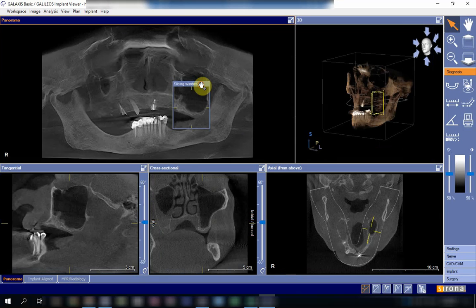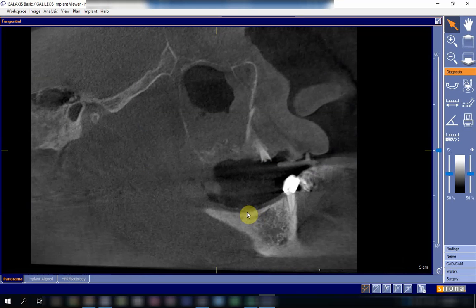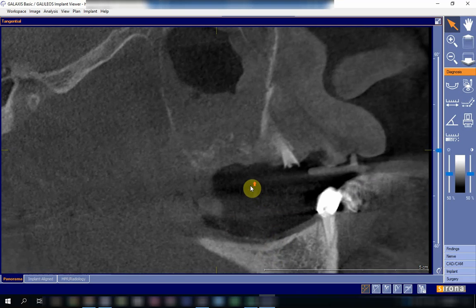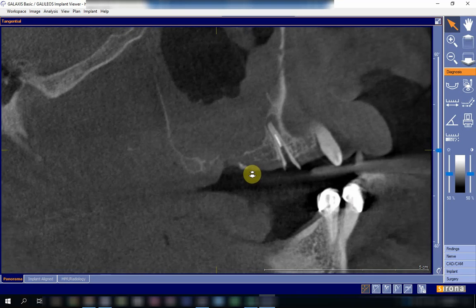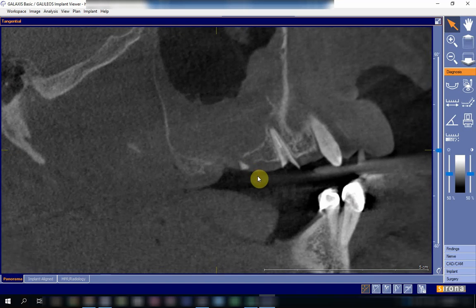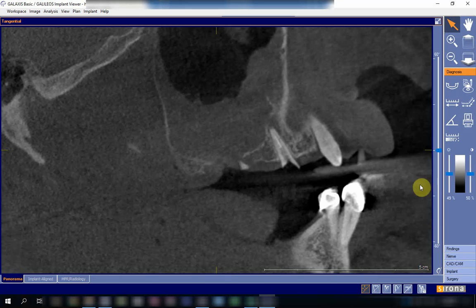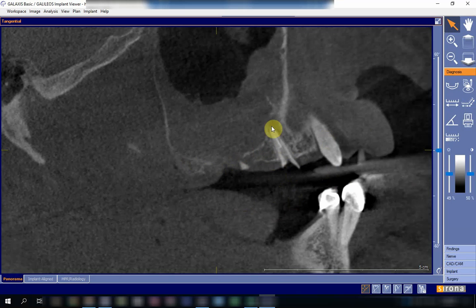Going to the right side where the problem happened, we can see that the bone was minimal — there was virtually no bone between the floor of the sinus and the oral cavity. In the premolar area, which seems to be the greatest thickness, it is only around four millimeters, and in other areas it is only about one millimeter.